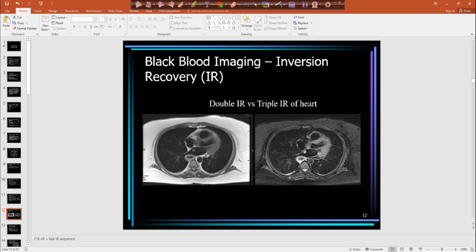There was something in the aortic. Not sure. Okay. What is that? Is it a circle, square? Describe the shape. That area of signal in there. Right here? Yeah. Right here.